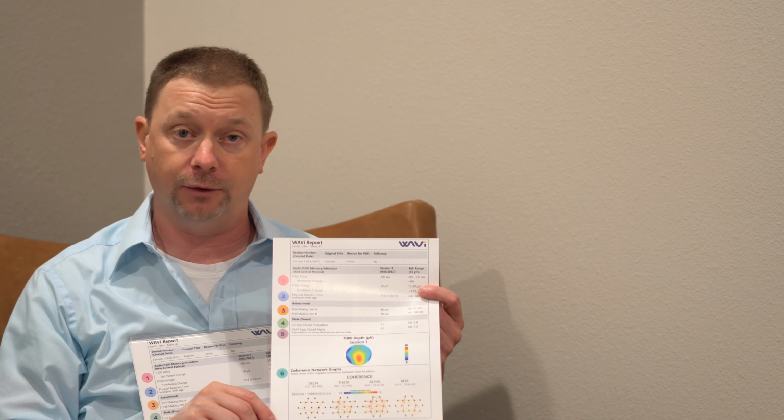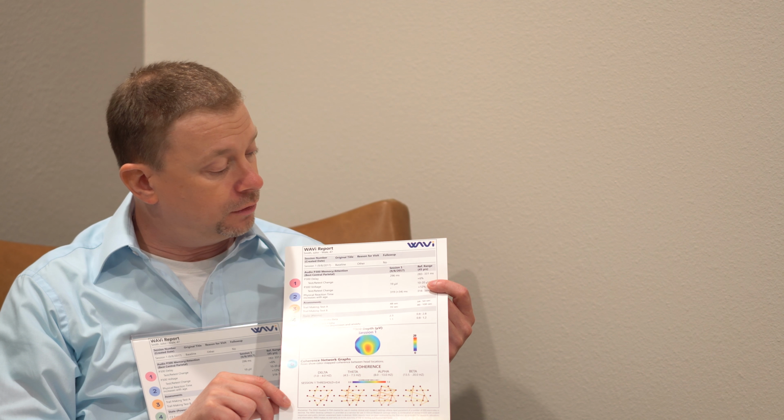Now, on a side note, many of your doctors and physicians may have worked with P300s before, and there is an auditory P300, which is the most common. That's the one where you listen to those oddball sounds. But there are also visual P300s, for those of you that may have heard of that, or for patients that are deaf.